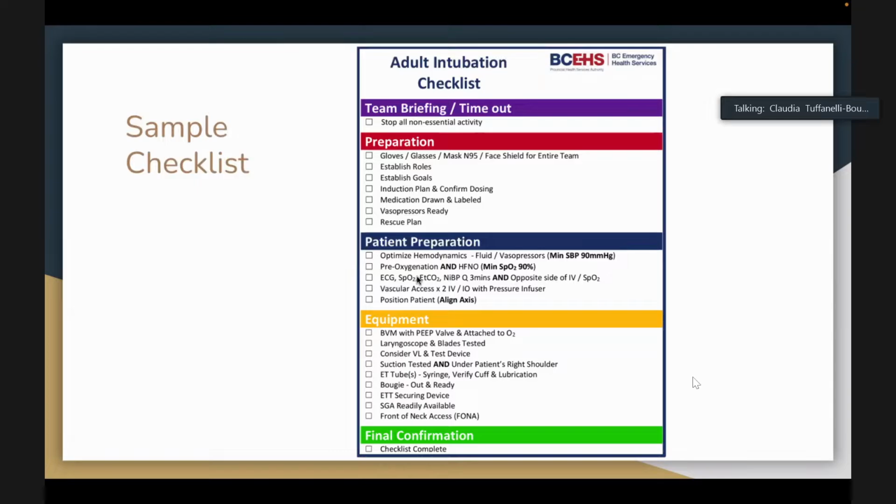So here's that checklist I talked about. You just go through and make sure you have everything. And if you can remember all this, or you're at the point where you've done a lot, that's okay. You don't necessarily need it, but it is really good. And it can be good to have in the room if you're doing intubations, so the nurses and other staff can also check and make sure that you have everything, and they can help with some of this stuff. They can help gather it. If you have a good respiratory therapist, they're usually getting a lot of your stuff ready, or a nurse that helps. And so making sure they know what you need and everybody's on the same page is really helpful.